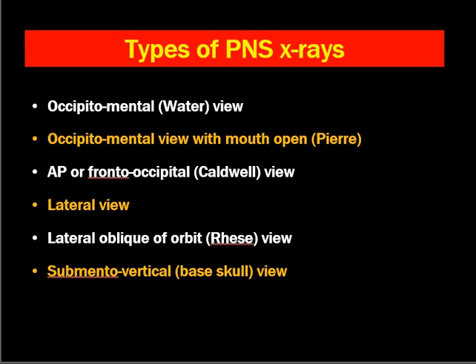Next is AP or fronto-occipital view, that is Caldwell view, lateral view, lateral oblique view of the orbit, that is Rhese view, and submentovertical skull base view. But in routine clinical practice, we only perform occipitomental and occipitomental with mouth open, that is Waters and Pierre's view.